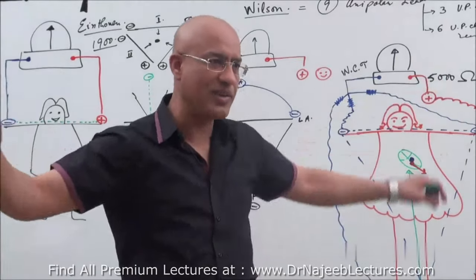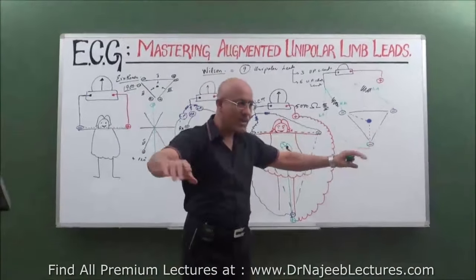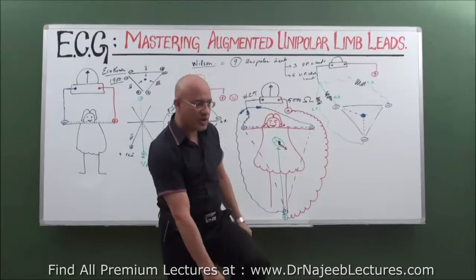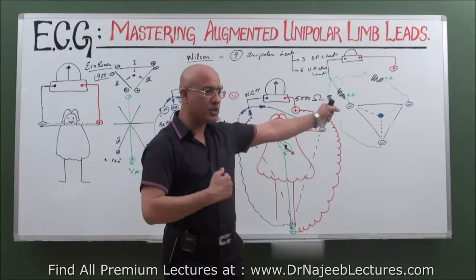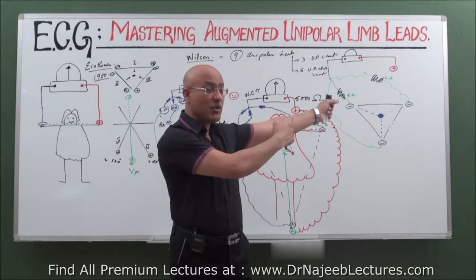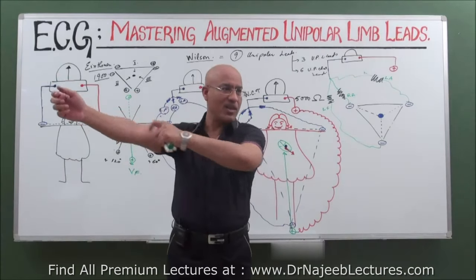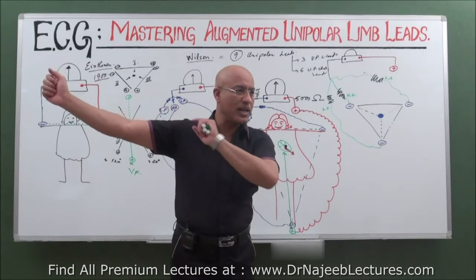Put negative here, negative here, negative there. Achieve the indifferent electrode in the center of the heart. Done? Then he has this dangling, which one? Positive electrode. Now, if you put the positive electrode on the foot, the line will be from heart to the foot. If you put the positive electrode on the left arm, the axis will be leftward and upward from the heart. If you put positive electrode here, he will achieve another lead, which is from heart to rightward and upward.